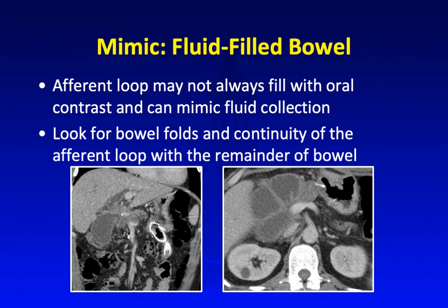Something to be aware of is that fluid-filled bowel can mimic a fluid collection, especially in Whipple procedures where the afferent loop — due to altered nerve supply — tends to be more distended and fluid-filled than the rest of the bowel, and may not fill with oral contrast. The important clue is knowing what procedure the patient had, looking for signs of bowel folds and bowel wall signatures, and confirming that the so-called fluid collection is contiguous with the rest of the bowel.